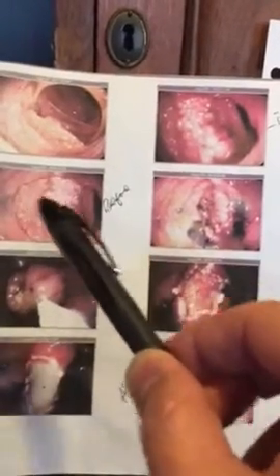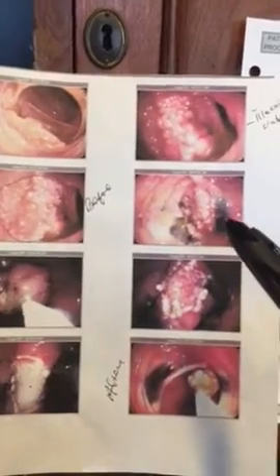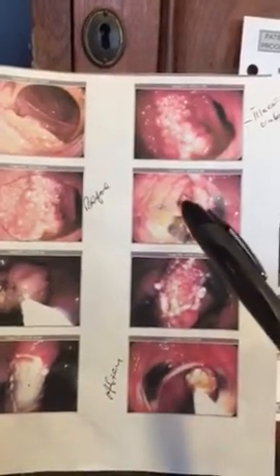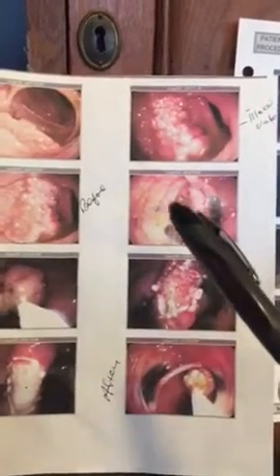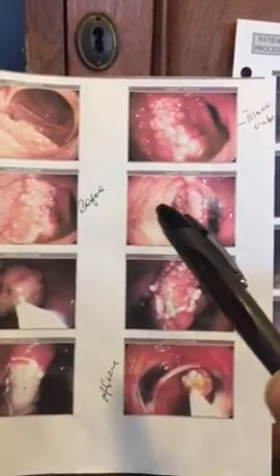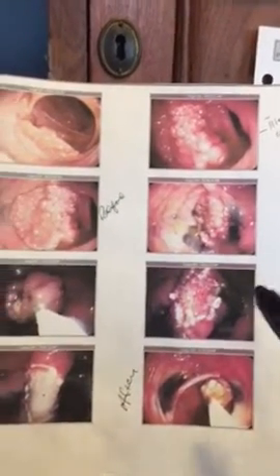This is before. This is during the process of the endoscopic mucosal resection, where we're injecting a substance to lift this from the bowel wall. It also provides for hemostasis, and it provides a tattoo localization, so we know when we go back to look at this site again if there's any recurrence.